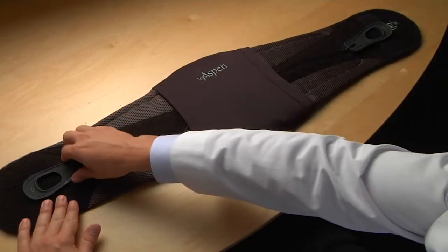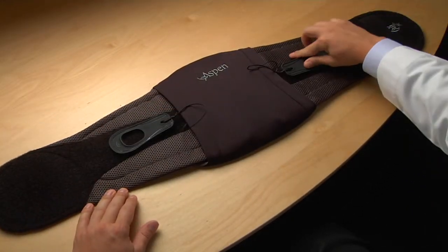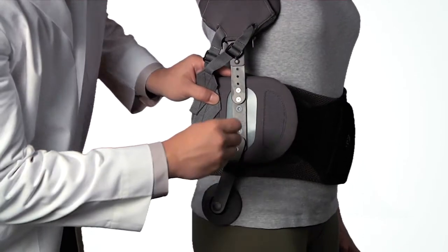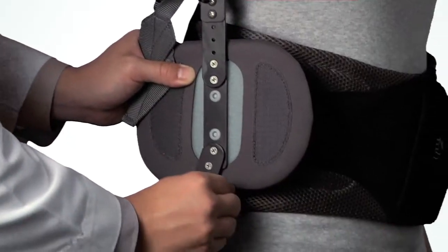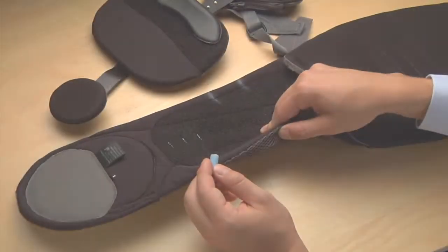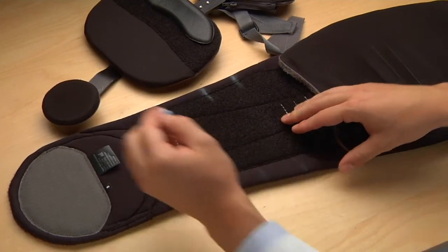Before the belt is applied, ensure that the pull tabs are positioned close to the center of the back panel so that the brace can be fully extended. With the belt applied, place the strut assembly over the belt in the proper position. With chalk, create four marks as shown. Transfer the marks to the inside of the belt — these will be used to position the strut assembly.